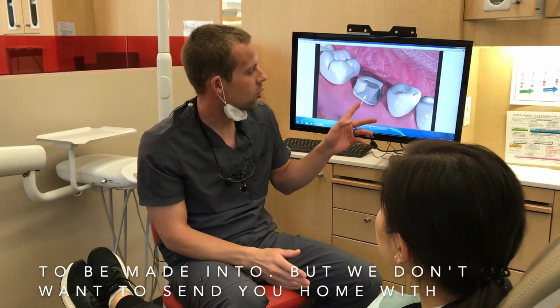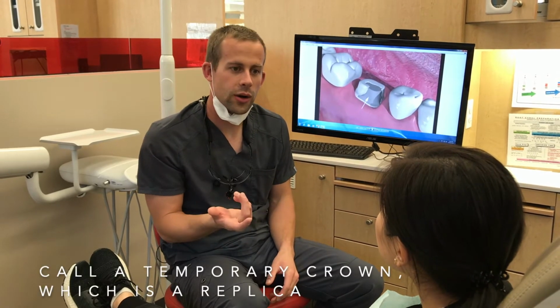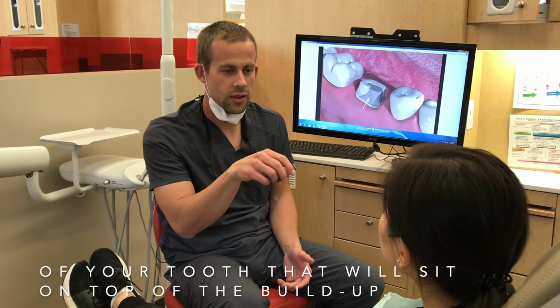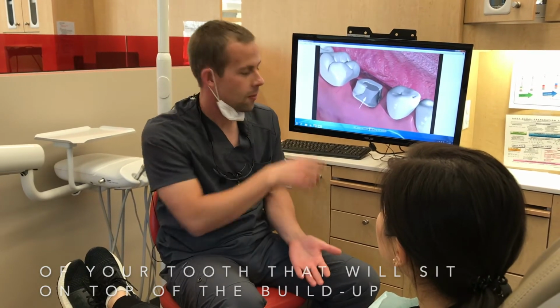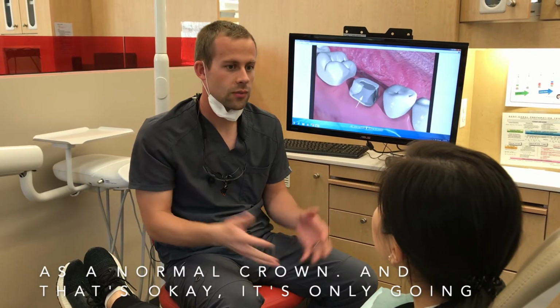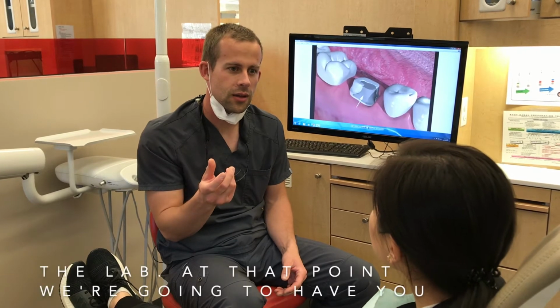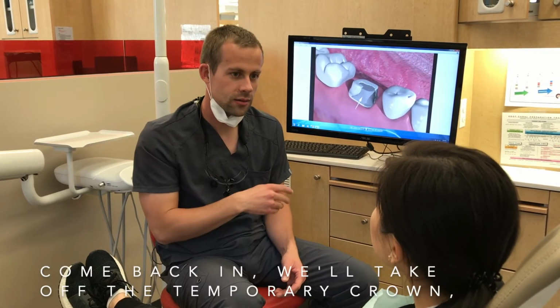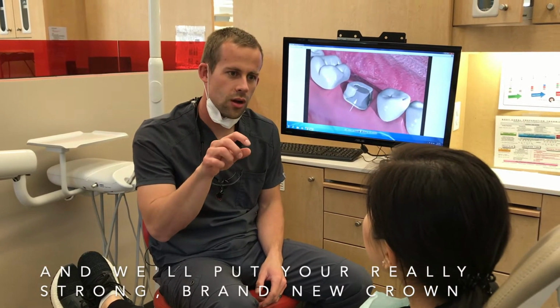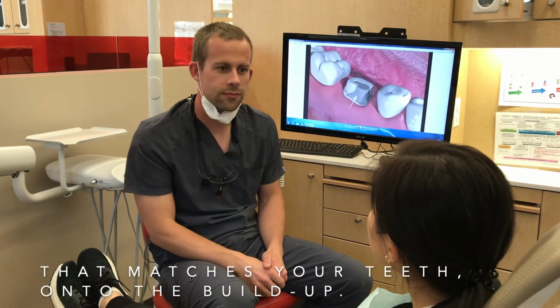But we don't want to send you home with a tooth that looks like this. We're going to make what we call a temporary crown, which is a replica of your tooth that will sit on top of the buildup, but it won't be as strong and it won't last as long as a normal crown, and that's okay. It's only going to last 1 to 2 weeks until the actual crown is made by the lab. At that point, we'll have you come back in, we'll take off the temporary crown, and we'll put your really strong, brand new crown that matches your teeth onto the buildup.